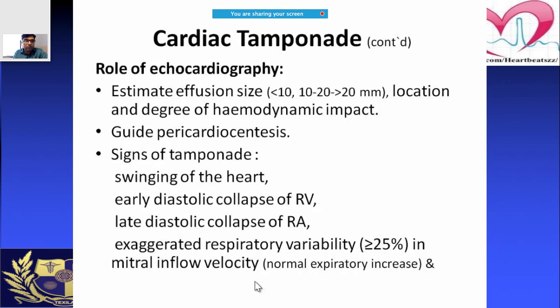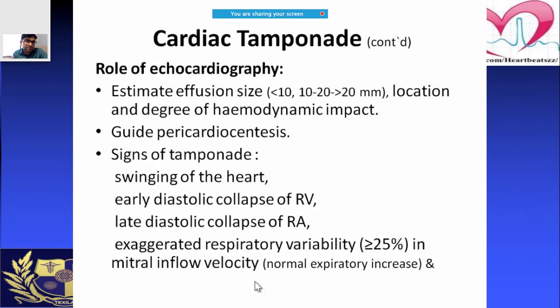Echo signs of cardiac tamponade include swinging movement of the heart, early diastolic collapse of the right ventricle, and late diastolic collapse of the right atrium. Remember: early collapse for the RV, late collapse for the RA — they are opposite. Also look for exaggerated respiratory variation.